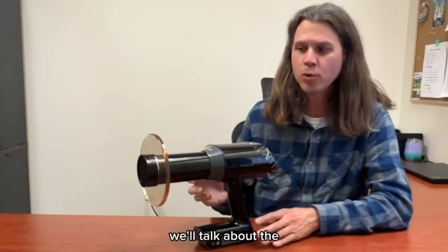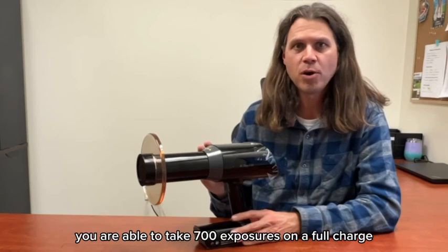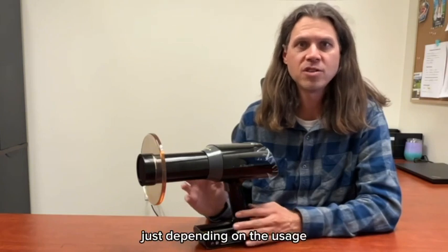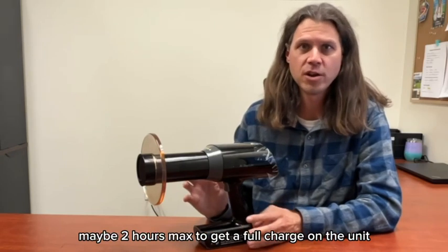First we'll talk about the warranty — it does come with a two-year warranty. You are able to take 700 exposures on a full charge, which should last you anywhere between three days to a little over a week depending on the usage. It should only take about an hour, maybe two hours max, to get a full charge on the unit, so that's nice too.